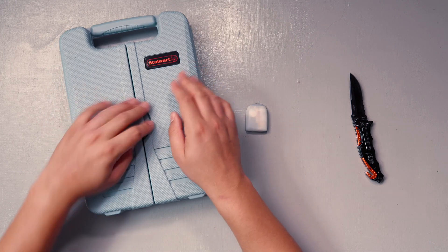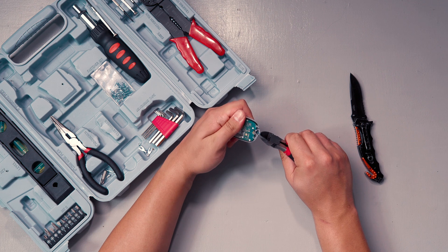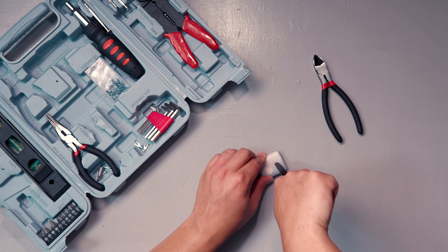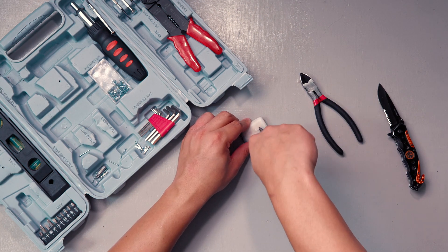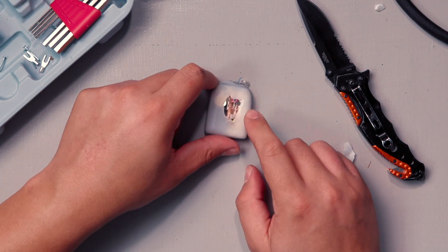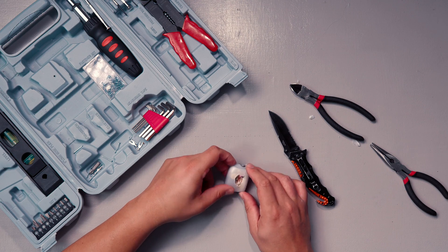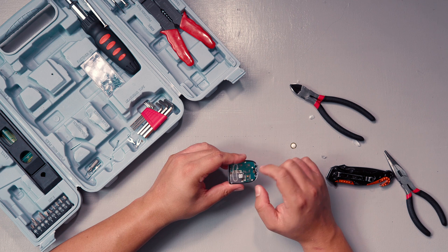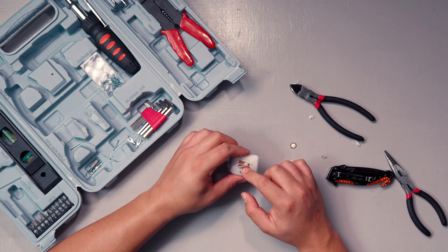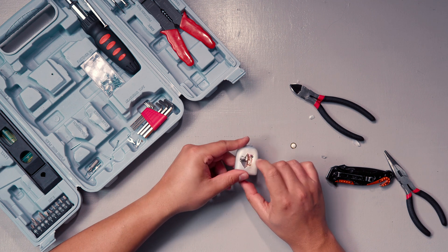Starting to break it apart is proving to be a little bit difficult, so we're going to introduce a tool. As you can tell, clearly I've done this before. But we're starting to see — if you look right here, this is actually how the needle inserts. This small motor gets instructions from the motherboard from the wireless signal to rotate.